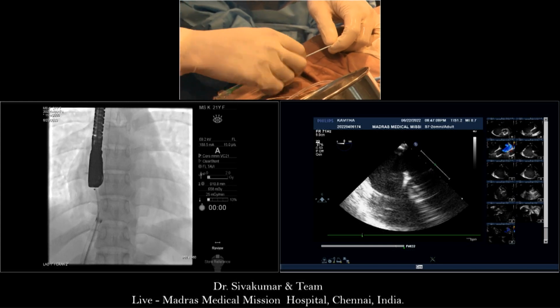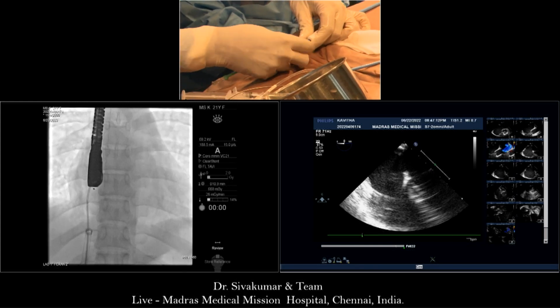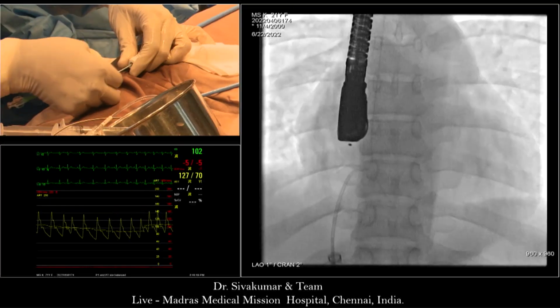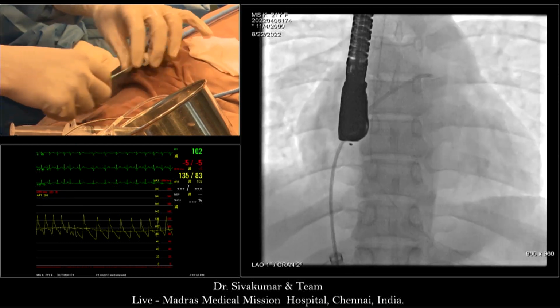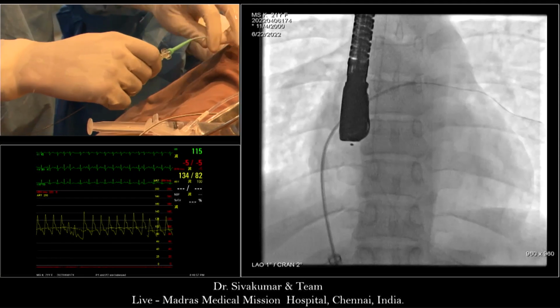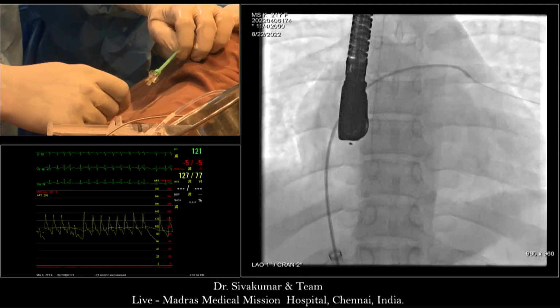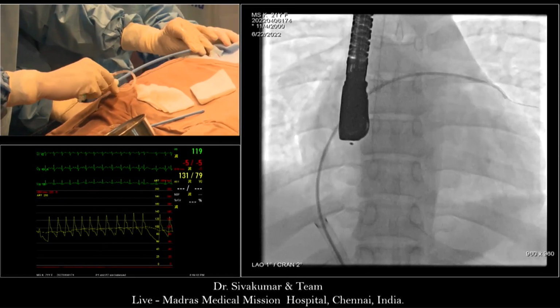I thought he was delivering the device, still the catheter. No, I pulled it out to the inferior. Whilst you're doing that, just out of interest, Bharat, you said balloon assisted, I was thinking whether you would do a right upper pulmonary vein. Even this technique is very good what he's doing, and more or less he's doing it predictably. So I think in this case, this is a technique.